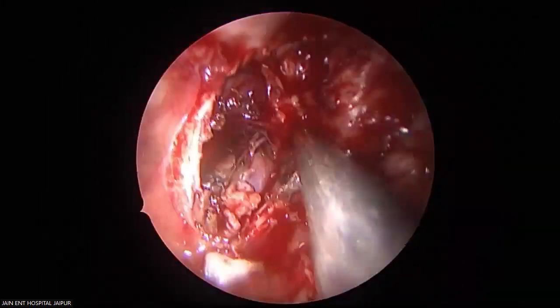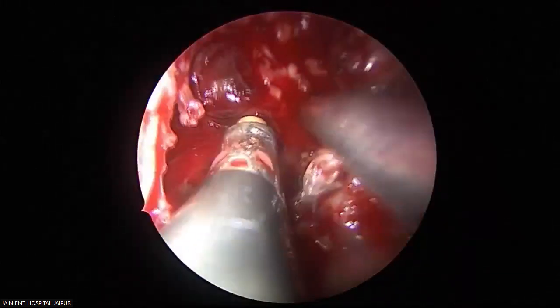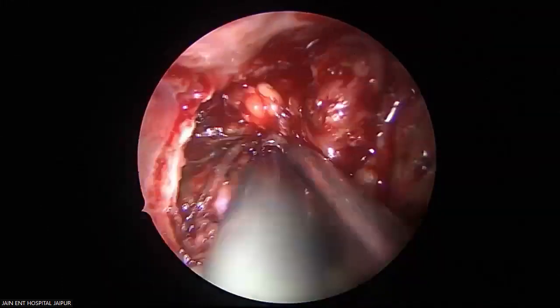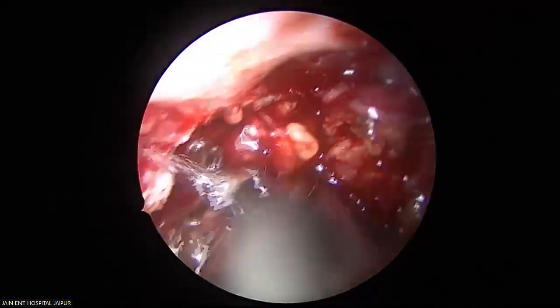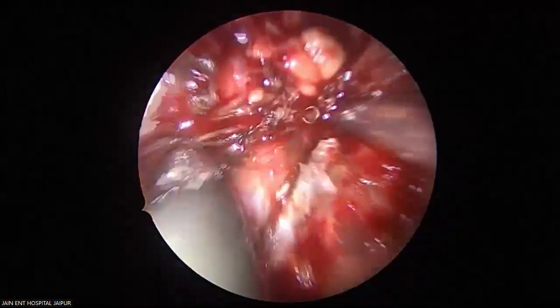We have more than adequate exposure for just coagulating the surface.